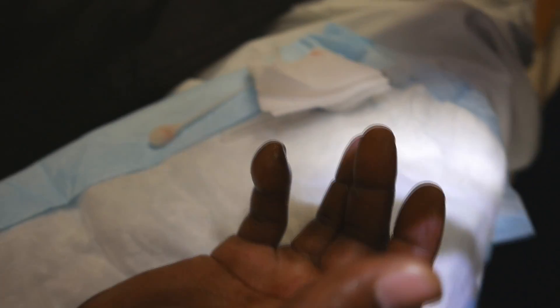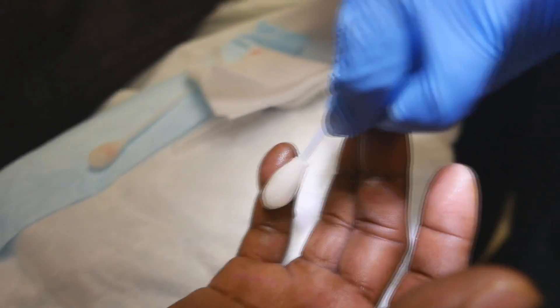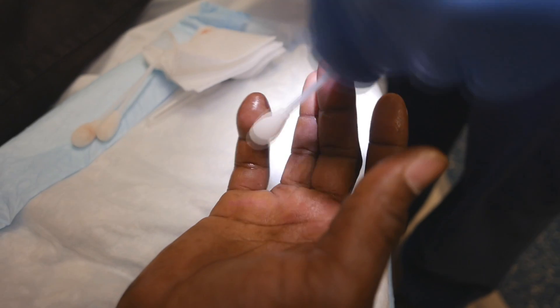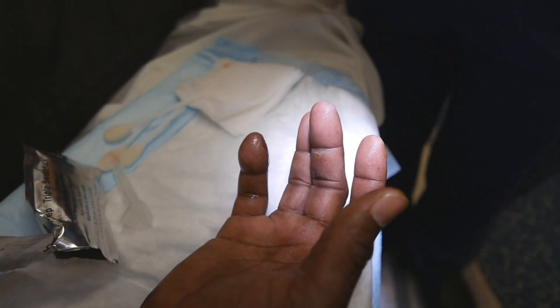You've already drained the paronychia that was associated with it. It kind of impresses me the number of times that paronychia and felons occur simultaneously. He's numbed up, he's had his digital block. I'm not guaranteeing I'm going to get anything out of here, but let's try.